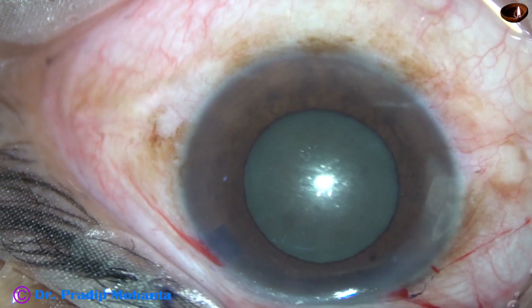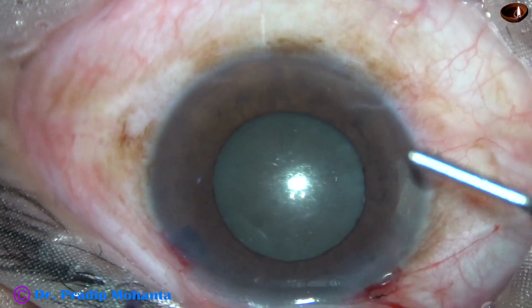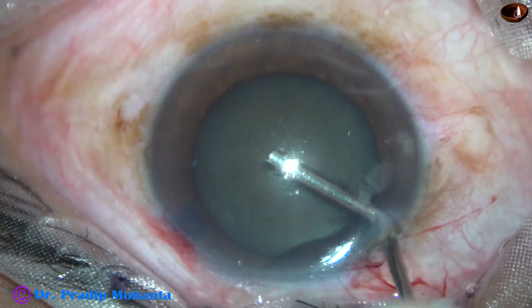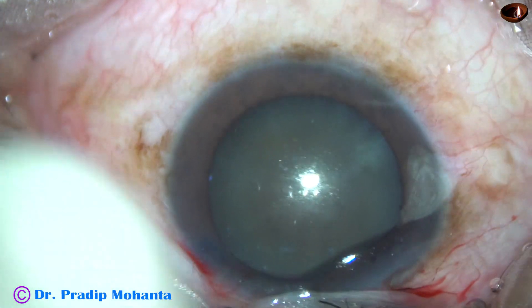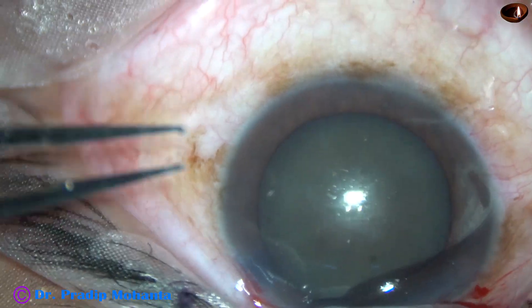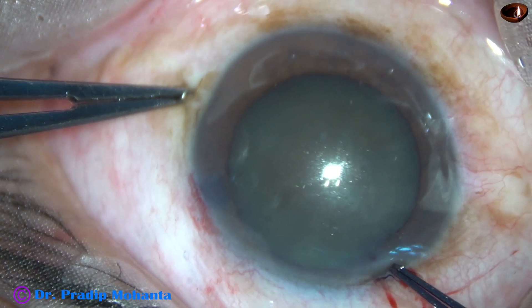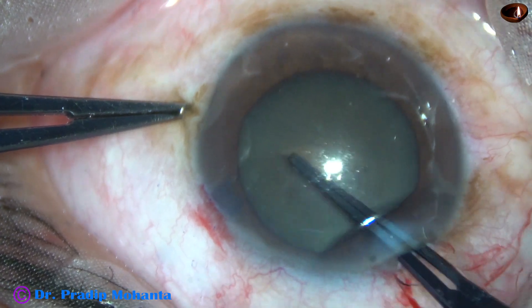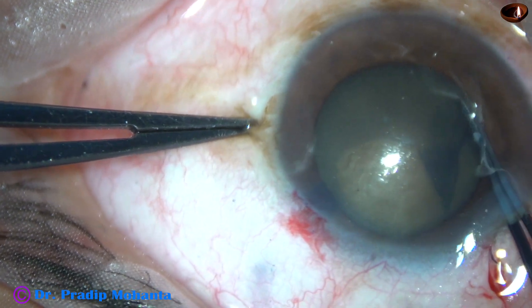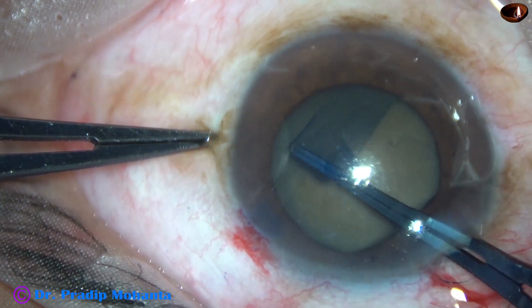As I washed the dye out, the pupil has started becoming small. And this is after injection of viscoelastic — the pupil has dilated again. Now I am going to do capsulorhexis. The patient is under topical anesthesia; the surgery is being done just by proparacaine eye drops applied over the ocular surface, because no intracameral anesthetic has been used.